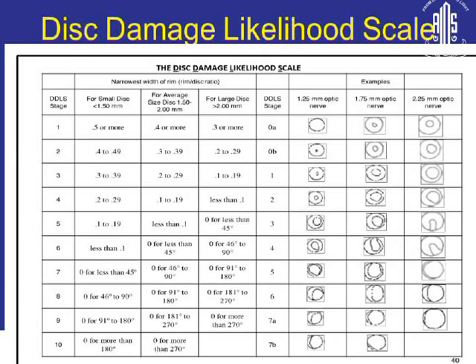And if you look at it carefully, the larger the disc is getting, the smaller he is allowing the thinnest portion to be. So in a large disc of more than 2 millimeters, the thinnest portion can be as thin as 0.3 and still be classified as 0A, which is normal. But as you go down, the area of thinning becomes lesser and lesser, and then you come to this grade 3 where you are having 0. 0 means it's a complete thinning, there is no rim, it is completely notched out right till the edge of the scleral rim.